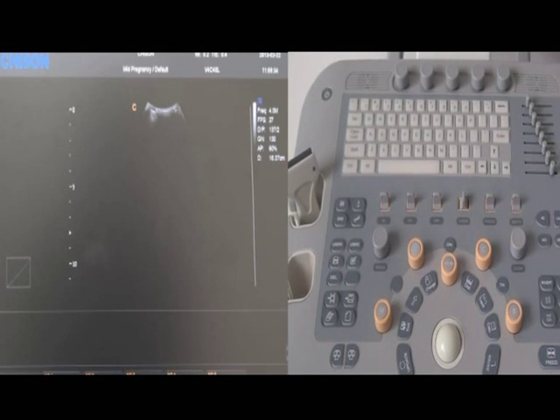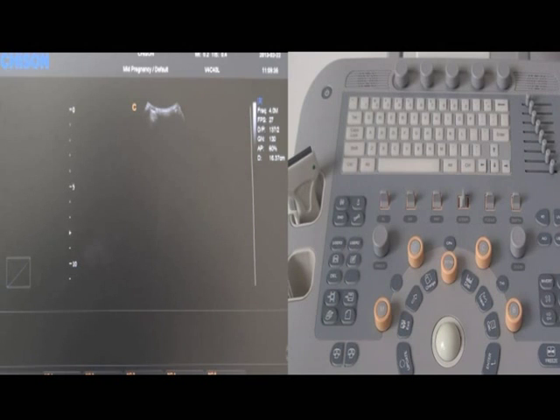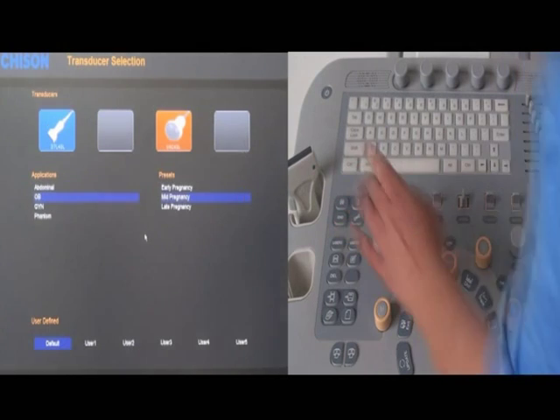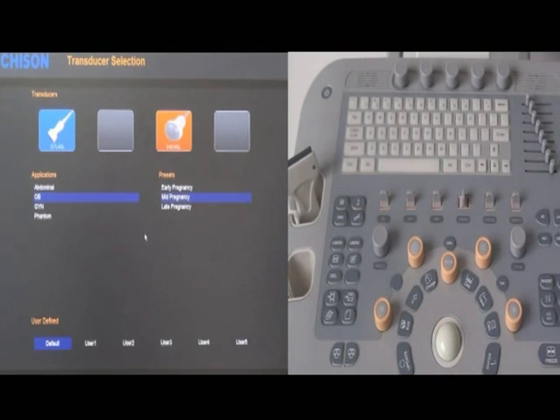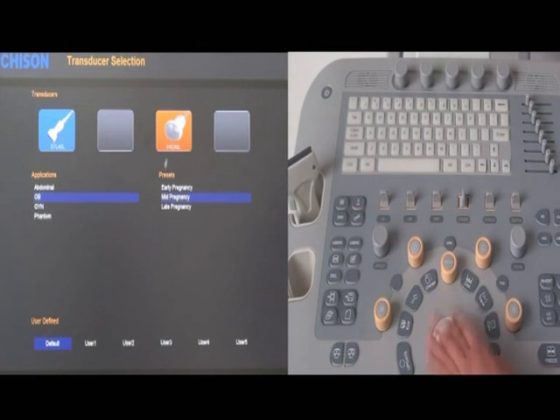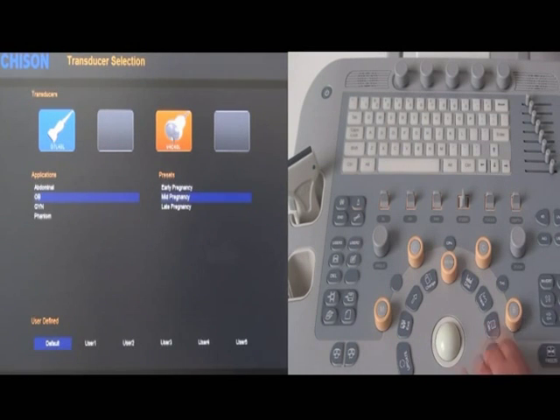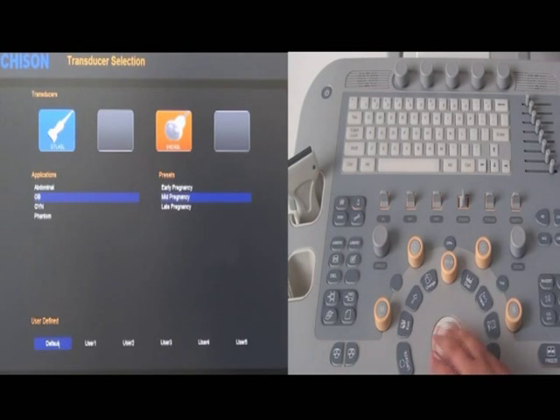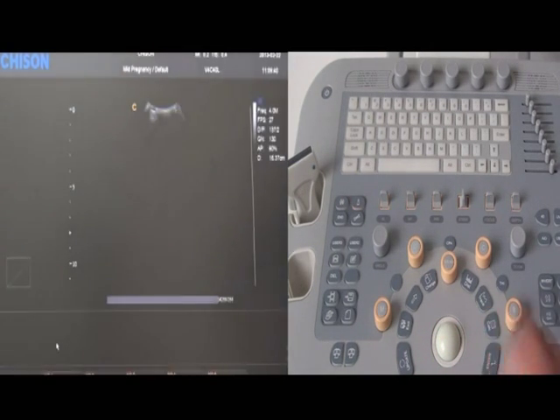In order to get a good 4D image, first of all we must have a good 2D image. Press the probe key to go to the probe selection screen. We get all the presets here. Choose the 4D probe, OB application, mid pregnancy and default mode. Click the enter key twice to start the B mode.